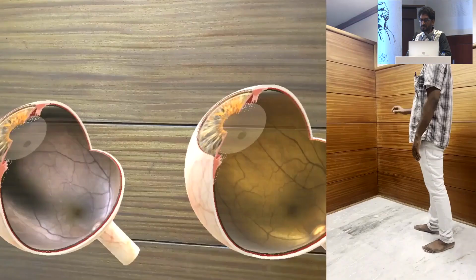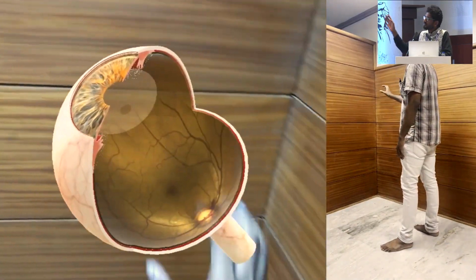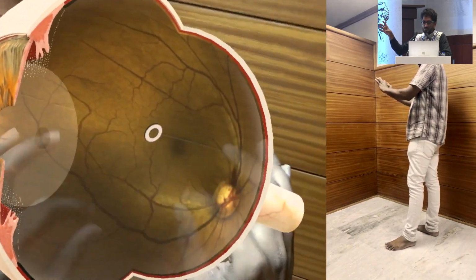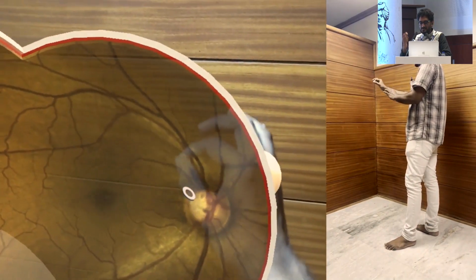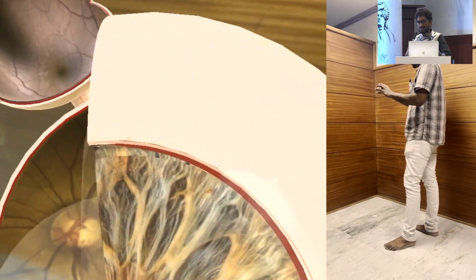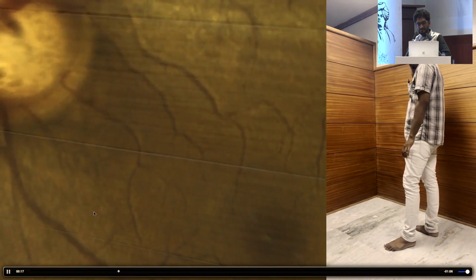The same models that we had created for smartphone learning, with this headset, the HoloLens that we got, you can see the models were embedded into the meshwork, with haptic touch sensation, a pseudo 4D or three-dimensional orientation, where the same examination of the patient, the eye being a three-dimensional organ, can be examined in 3D itself.